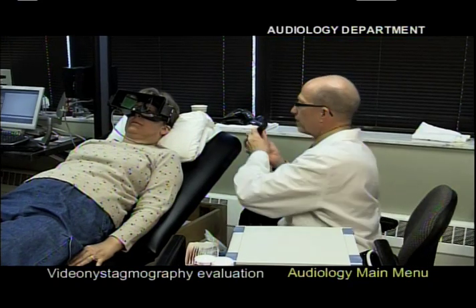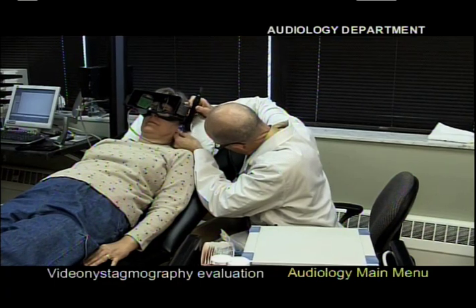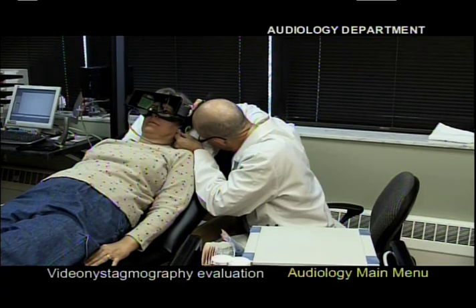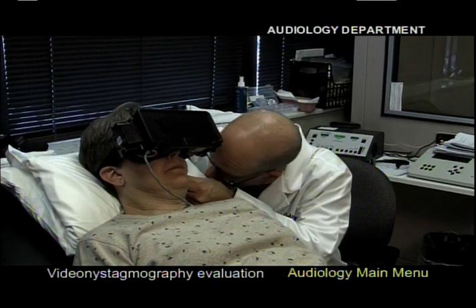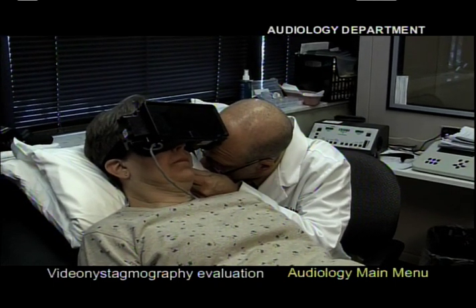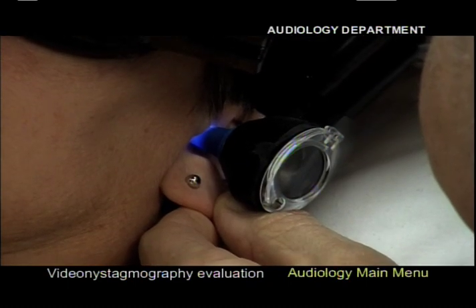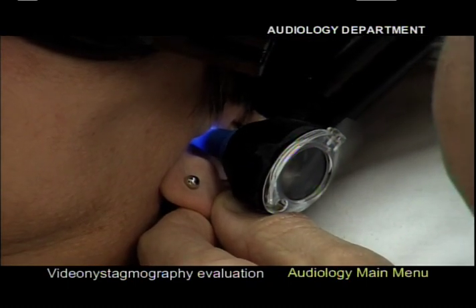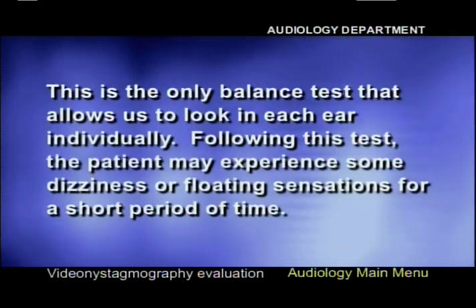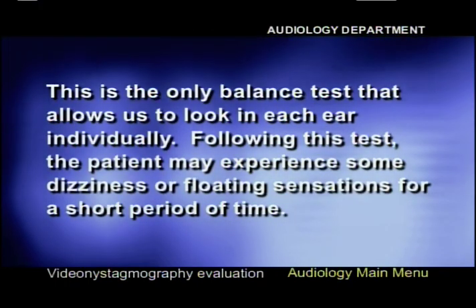Caloric testing involves administering irrigations of temperature-controlled air or water into the ear canal for 30 to 60 seconds. Generally, four irrigations are done — one each of cool and warm in each ear. Results allow us to assess the strength of a certain portion of the balance mechanism separately in each ear. This is the only balance test that allows us to look at each ear individually.